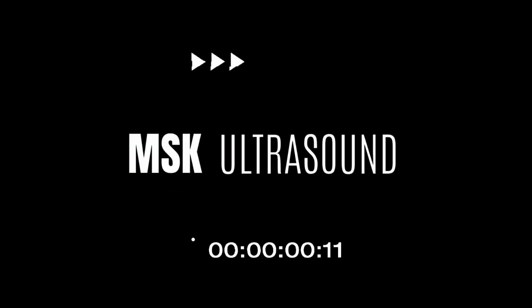The goal of this presentation is to show you some clinical examples of several pathologies of the carpal tunnel in musculoskeletal ultrasound. All pathologies presented are exemplary and serve as practice for the pathology checklist.